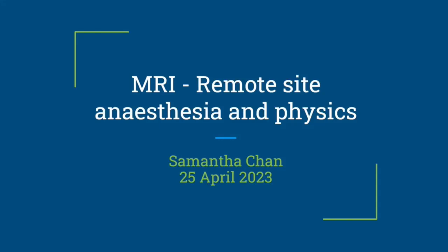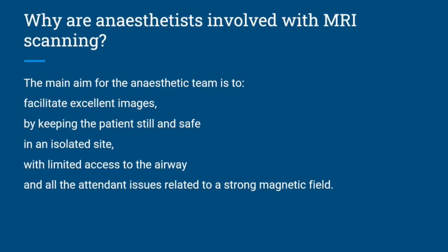Type of MRI stuff, where firstly, why are anaesthetists involved with MRI scanning? I took this off the AAGBI guidelines for MRIs, and we were there to facilitate good imaging, because you've got to be really still for the MRI, by keeping a patient still, keeping them safe.